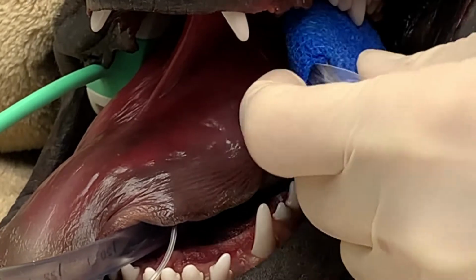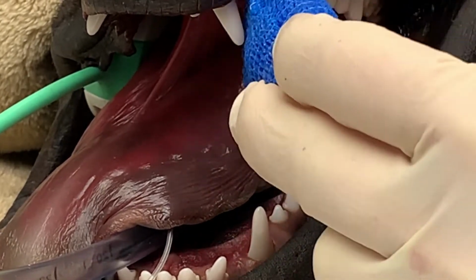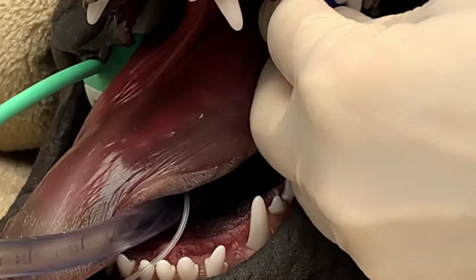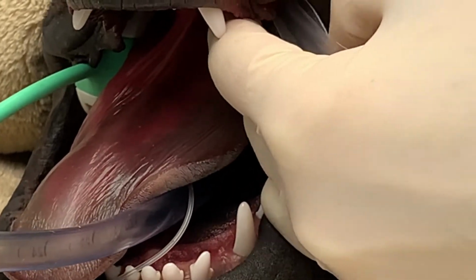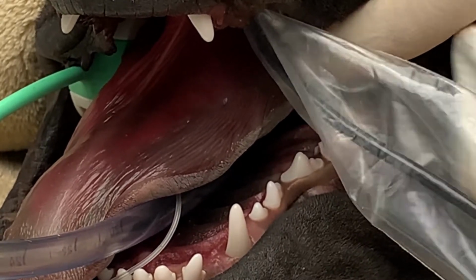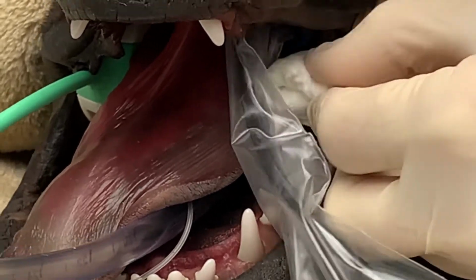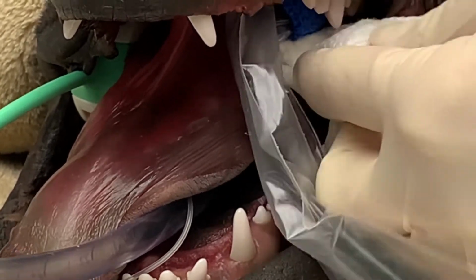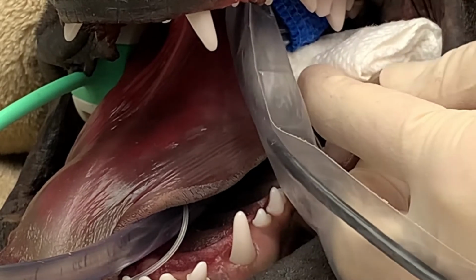We'll start with the caudal aspect, and we can now position our sensor for these caudal maxillary teeth. Once we get that sensor in place, we'll need things like positioning devices to help us keep that sensor stabilized. And we do this regardless of whether or not we're using a prop. So we position that in the mouth. Now our sensor is stable, and we can begin acquiring these images.